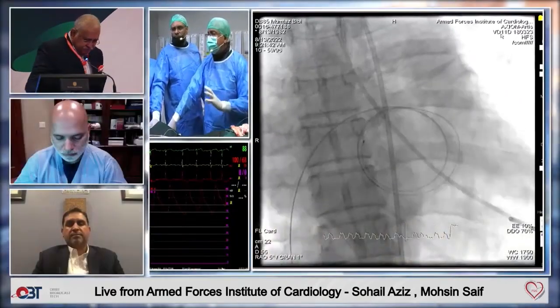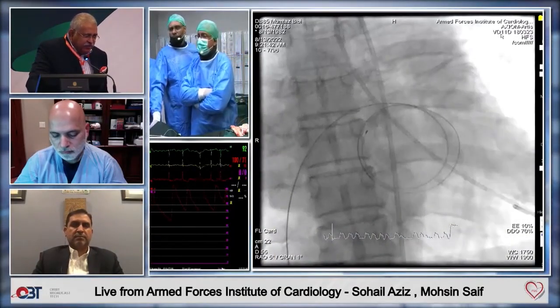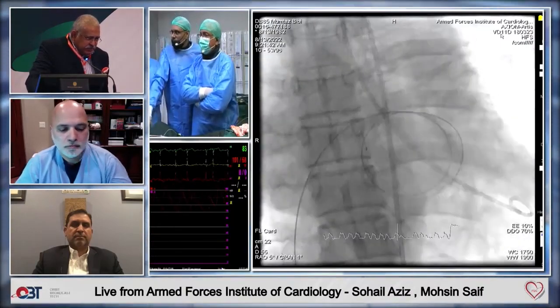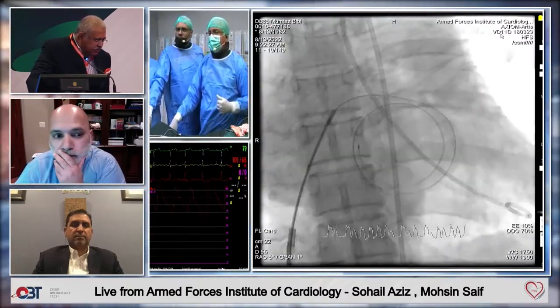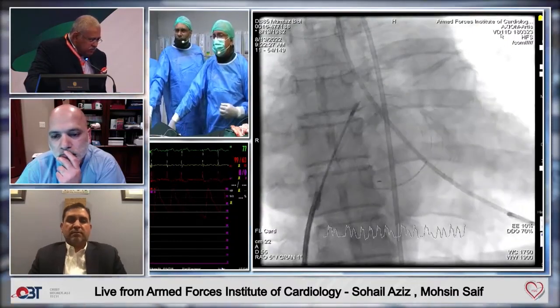Okay. Sohail sahab, can you wrap up the case because we have to have some talks. Yes, okay. What size of balloon have you used? She's 147, so we use a 26 balloon and stretch it to 25.